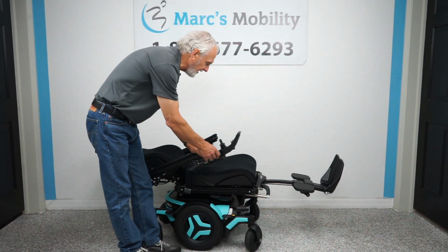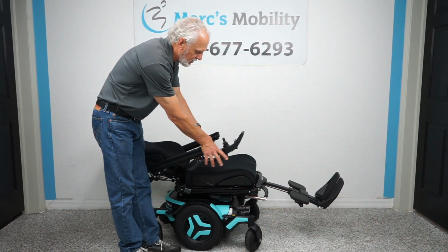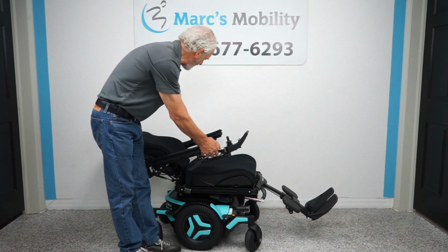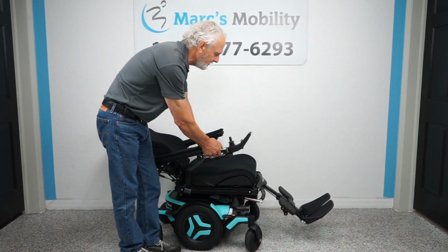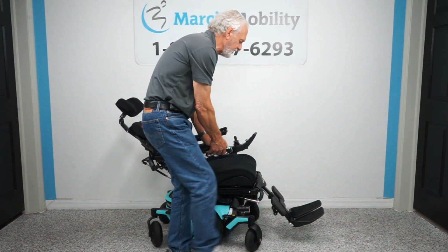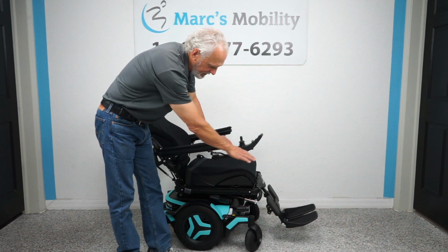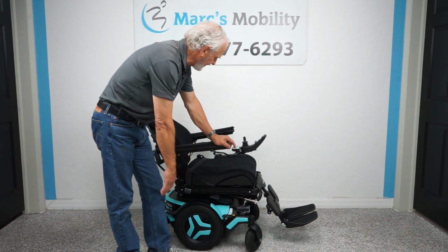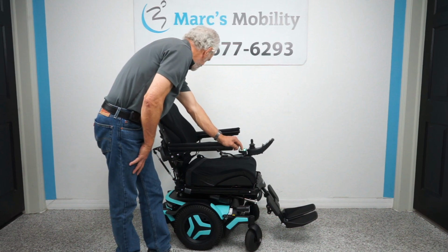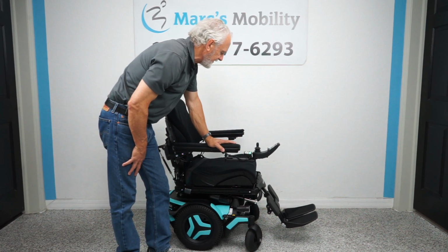So I'm going to bring the recline back up. I'm going to bring the feet back down. I'm hitting 2 buttons at one time. You can do that through the joystick also. If you want the legs to come down and the back to come up at the same time, you can do 2 functions at once. Now I'm going to leave the legs out just because that's the way most people will drive instead of having it all the way in. You would have it all the way in if you were in the house. So I'm going to bring them back up. All right, folks. Let's talk about the chair.